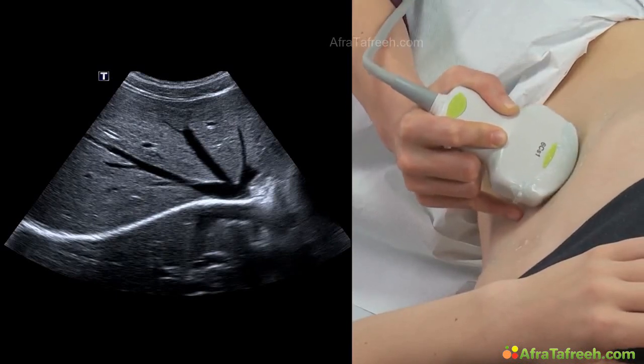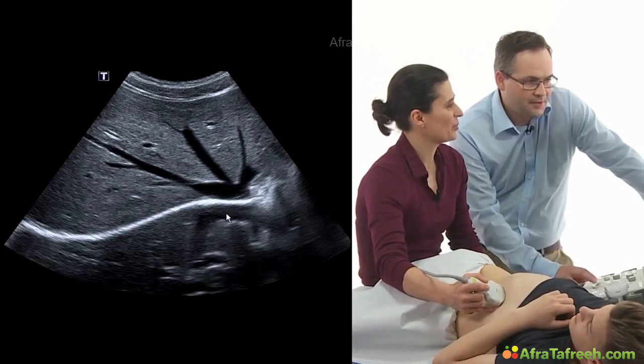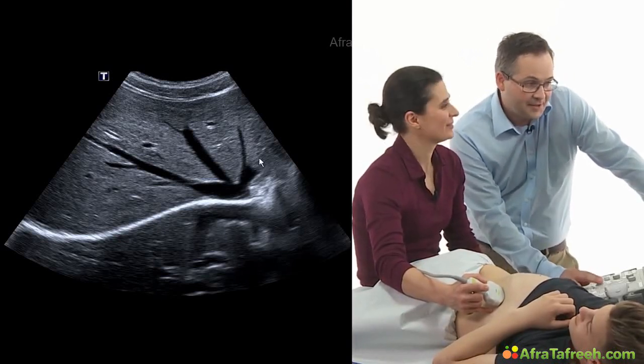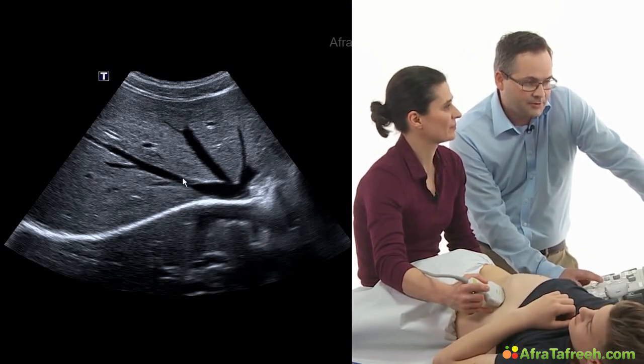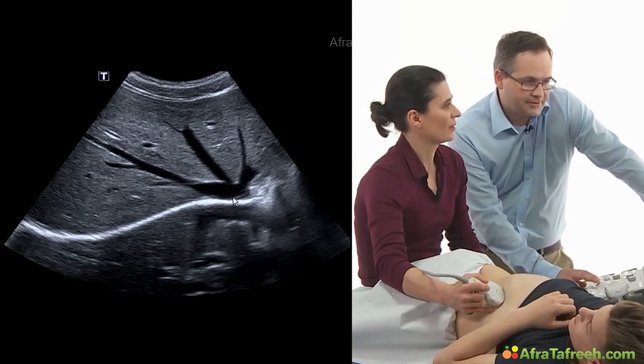Great. You can exhale, thank you. You got a perfect view on the liver veins. Yes. It's beautiful, isn't it? There are 3 liver veins, the left one, the middle one, and the right one, and the confluence to the vena cava inferior over here.